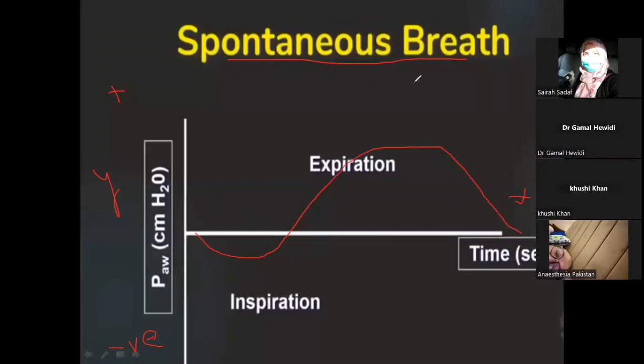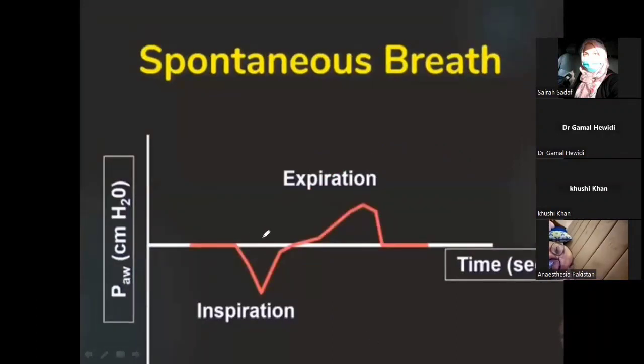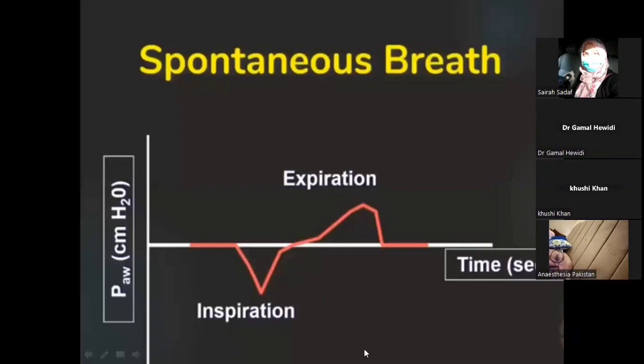Now just remember this, because we will encounter this thing at so many places. Okay, let's move to the next slide. As I have already told you, this is the negative breath, that is inspiration, and it goes up. This is the expiration. So that's easy, I hope.